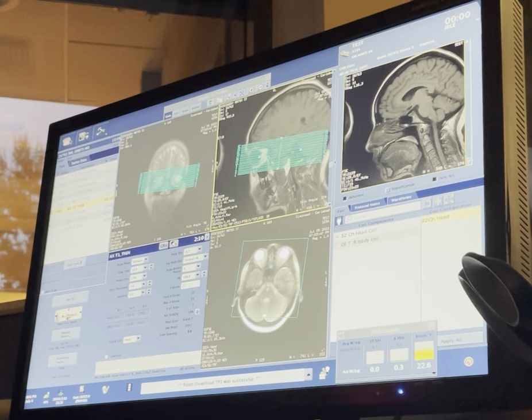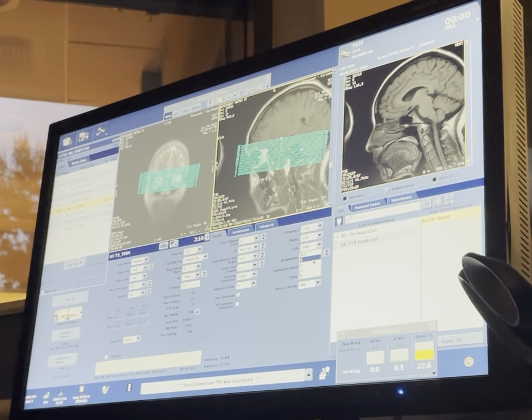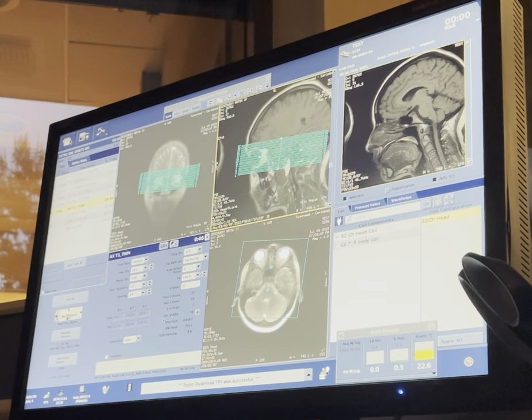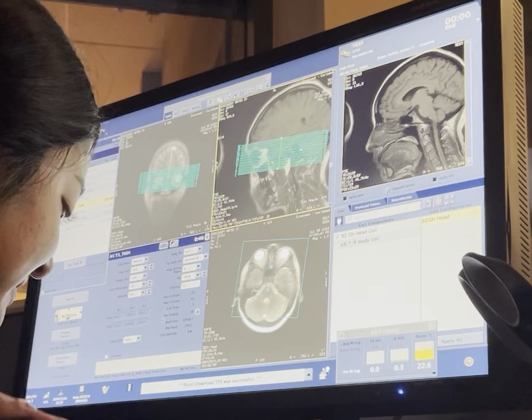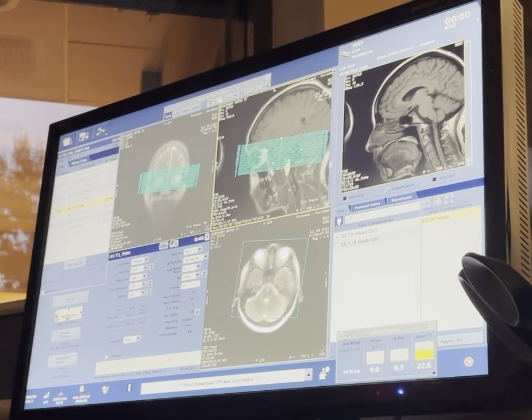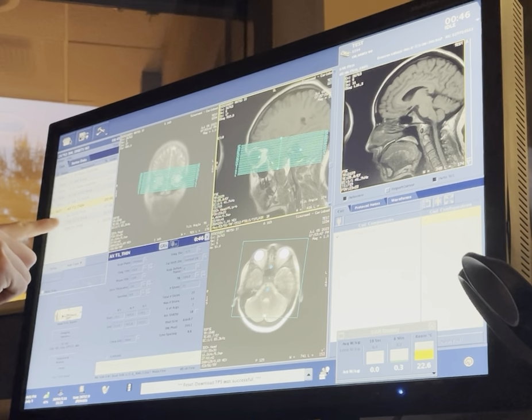So now you're gonna tell her, let's click that. Let's hide this. Just for time purposes, let's hide your axial. This? And I'm gonna have you drop your next one, let's do 1. And be like, okay, same thing. Close your eyes, look forward for 45 seconds. Okay. Hey, Ollie. I need you to close your eyes and look straight for 46 seconds, okay? She said yeah. Okay, now save and scan. And this one is linked to number 6. So this one planned itself.